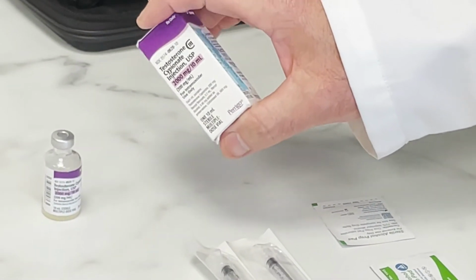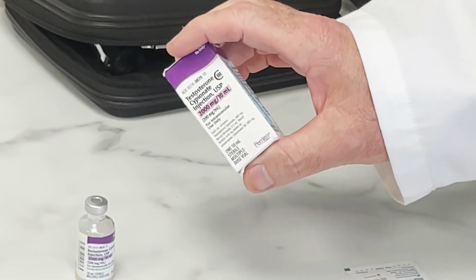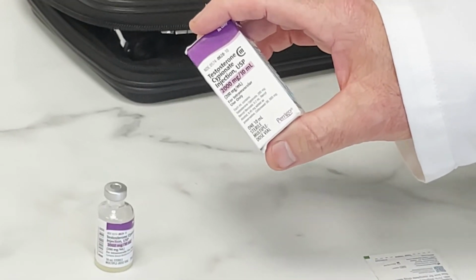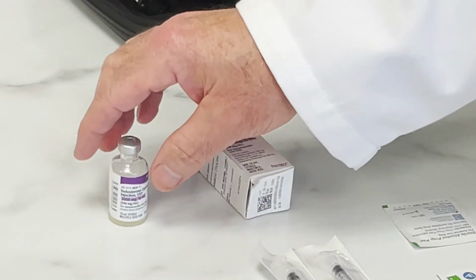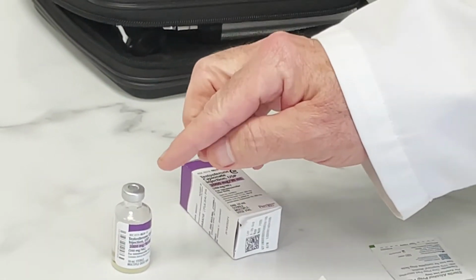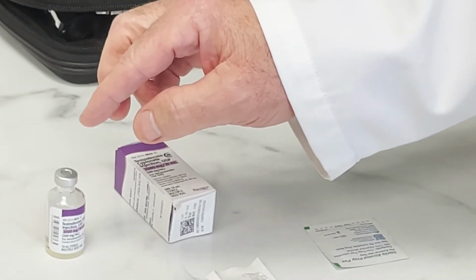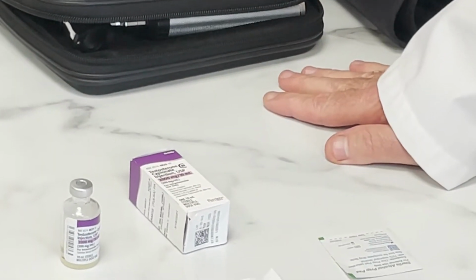This box may be different for your order of testosterone. It will be exactly the same medication, but don't be alarmed if the color is different. It will differ based on the drug manufacturer that the pharmacy has sent to you. And this is a vial that's already been opened. When you receive your medication, this vial will come with a plastic cap that is a pharmaceutical seal. Once you receive this, you can just pull the plastic cap off.